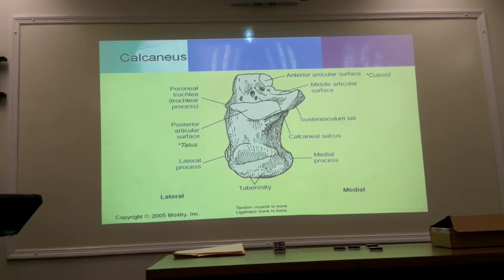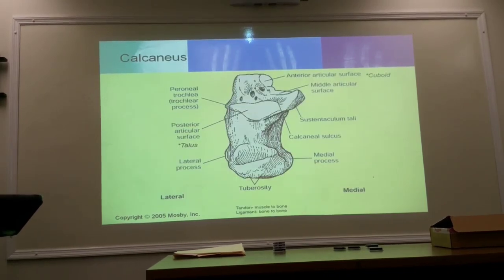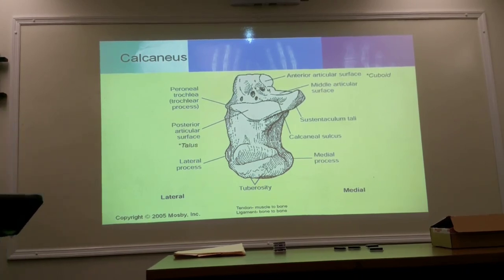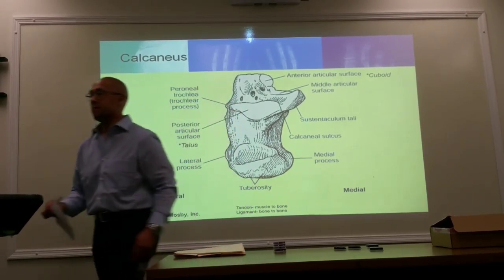Can you guys mark that on your slides? So this is the right, so not to confuse this with the left. I find they do that a lot with the book. The book is mislabeled. For this particular heel, this is the left, and in this slide right here, that's a right heel. In the book, page 214, figure 6.6, that's a left calcaneus.